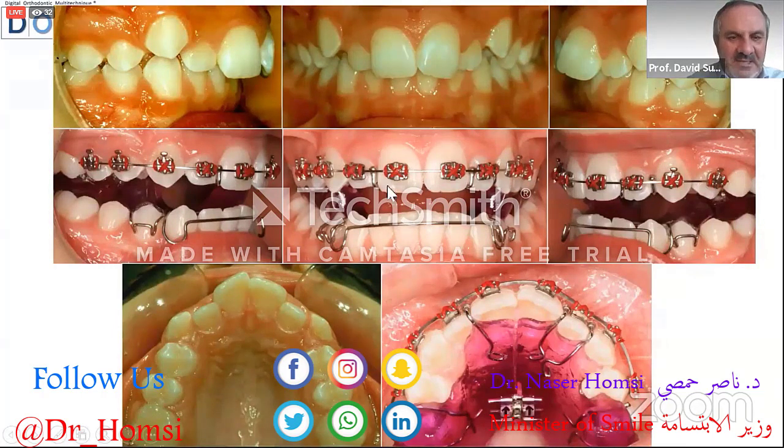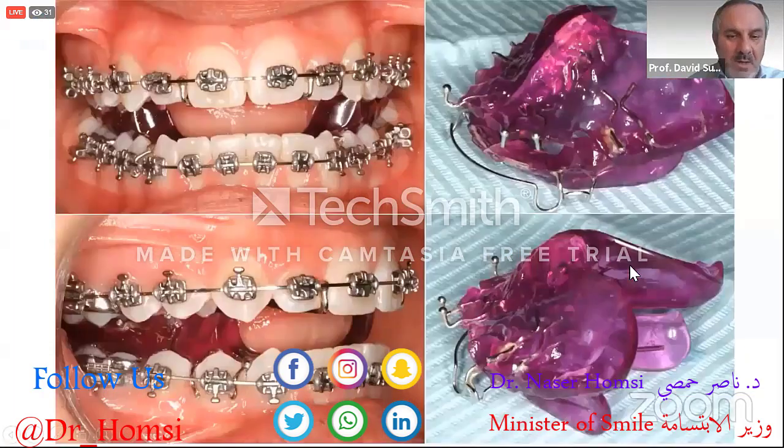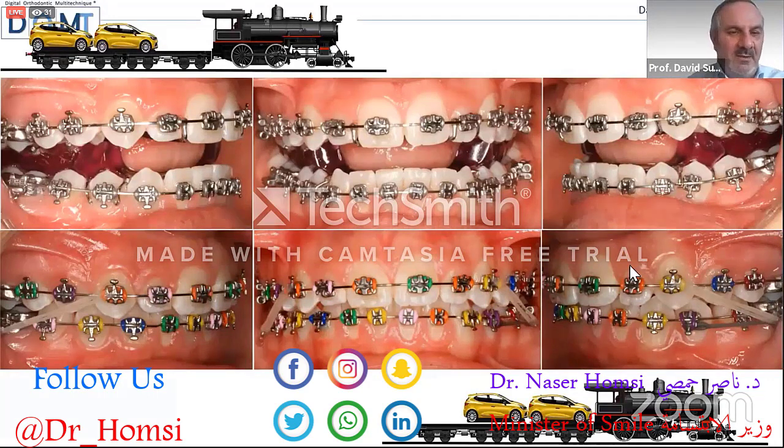The first step is to align the teeth, to increase the overjet, and to create the space to move the mandible forward. After, we use the twin block, the digital or conventional twin block, at the same time as the brackets and the wires. Now there is a new periodontal proprioception, and the patient presents the jumping of the bite. This is a concept from Angle.